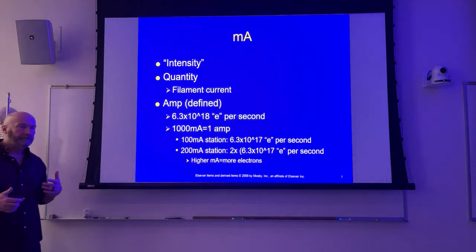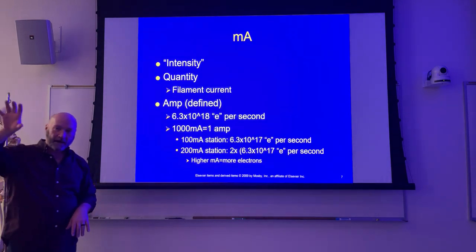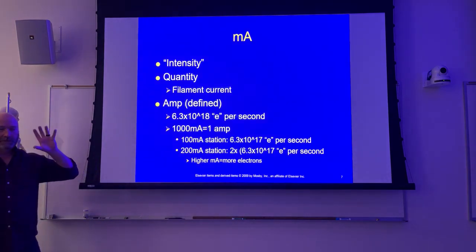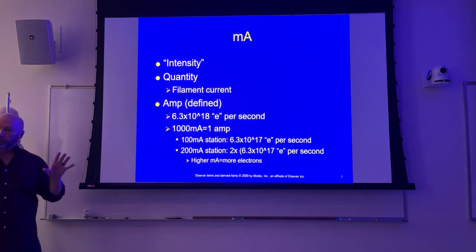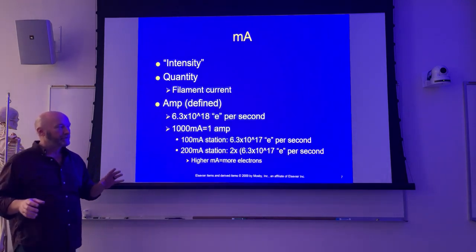Remember that, as I've drawn it, we've got two separate circuits. We've got the high energy circuit, and we've even got two portions to that: a low voltage and a high voltage portion. The low voltage portion is before the high voltage transformer, and the high voltage portion is on the other side of it.